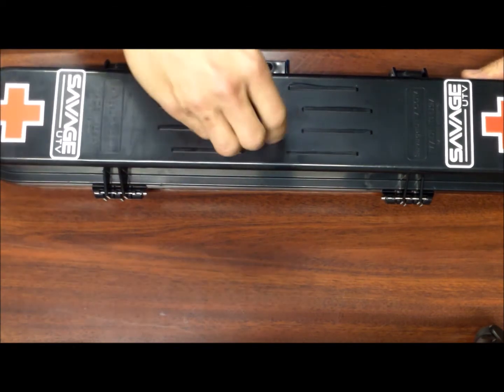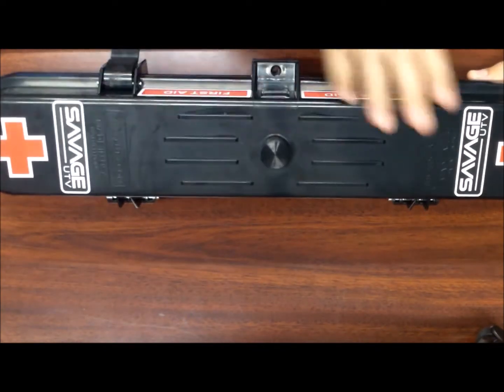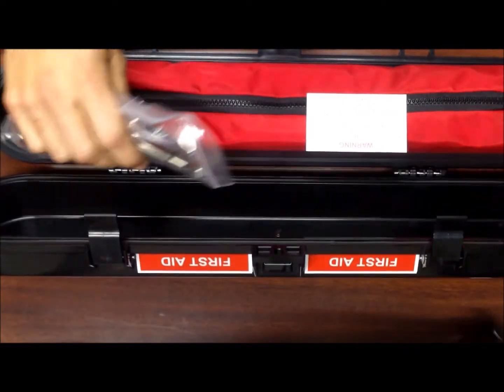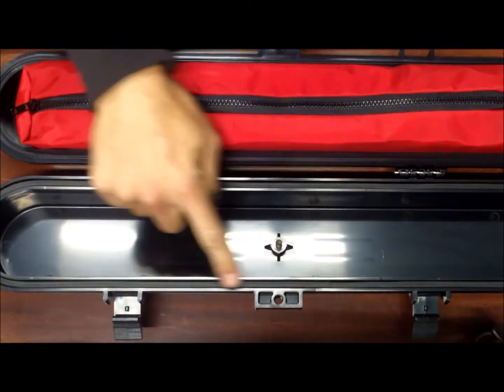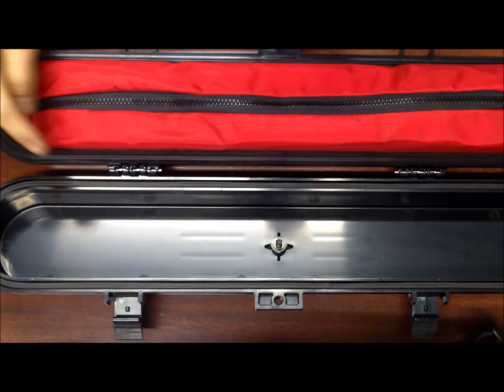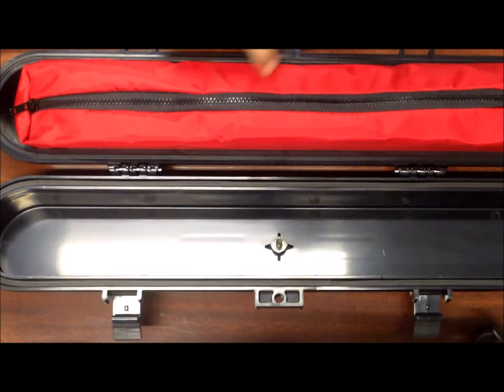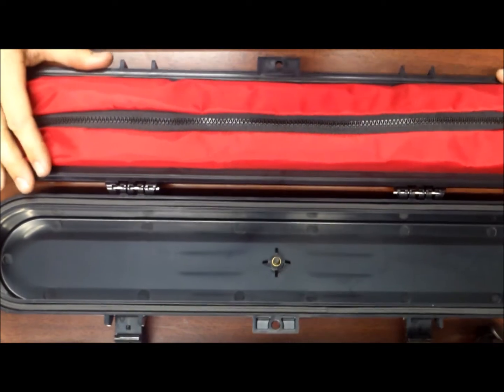Just like a Pelican case, you just let some air in and it'll allow you to open it — that's how tight these cases seal. Opening this up, you can see it comes with all the mounting hardware and a little disclaimer about the first aid kit. You can see there's a rubber seal and a raised edge that goes all the way around the case to create two points of contact on that seal to make sure it is waterproof and airtight.